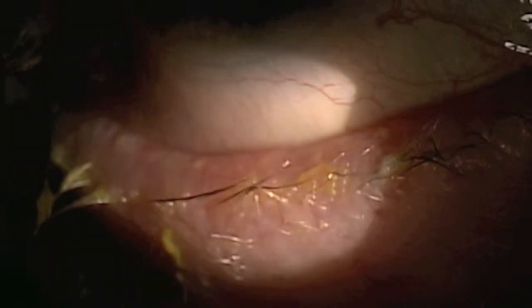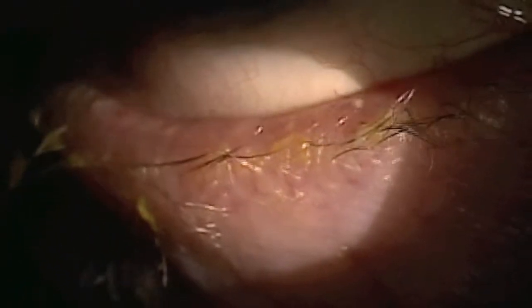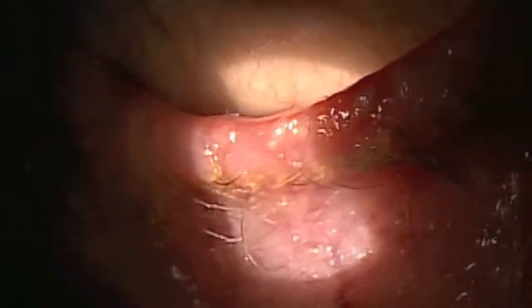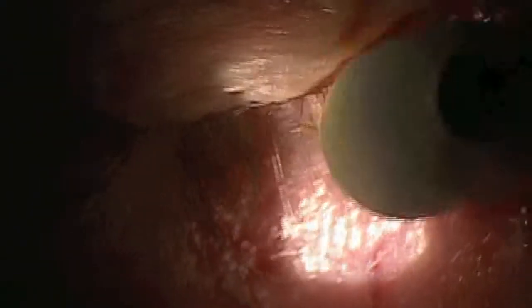We are now going to perform a micro blepharoexfoliation using the new BlefX device. The tip of the BlefX device is being soaked in a lid cleansing solution and is now being used to begin the exfoliation and debridement of the bacterial biofilm along the margin of the lids.